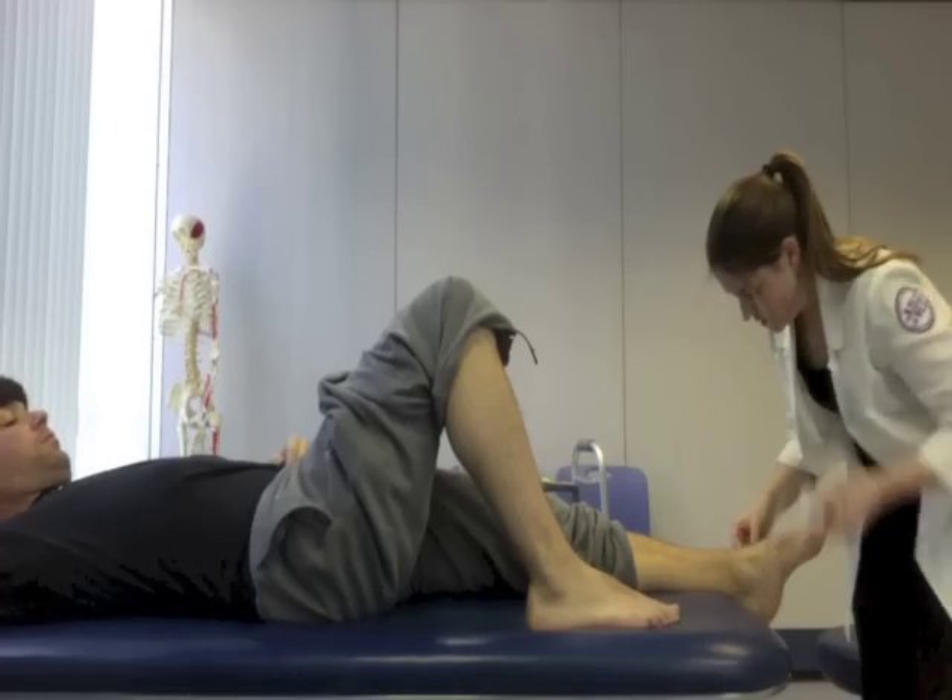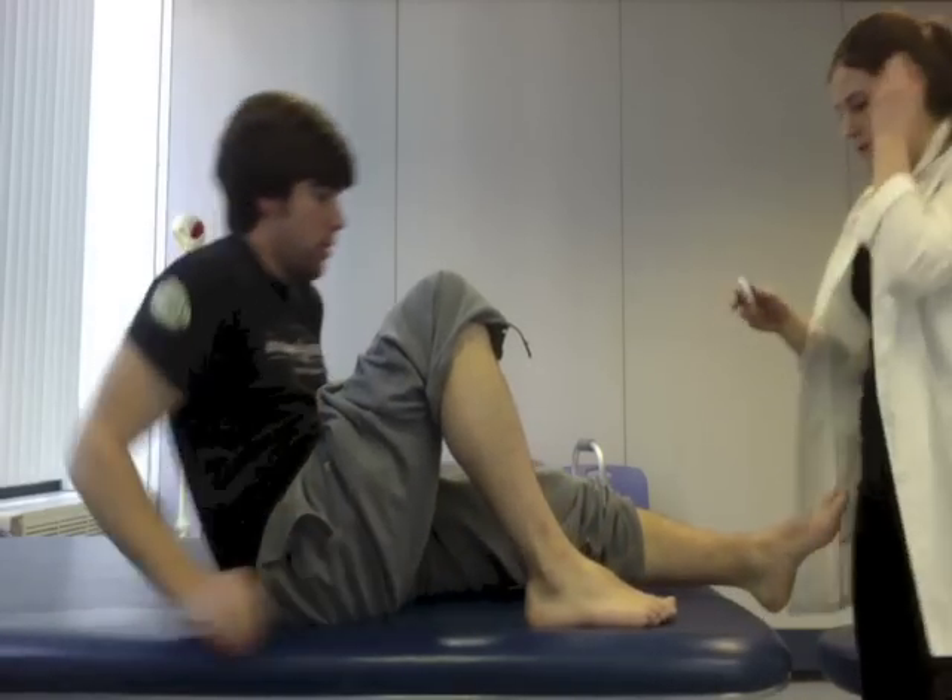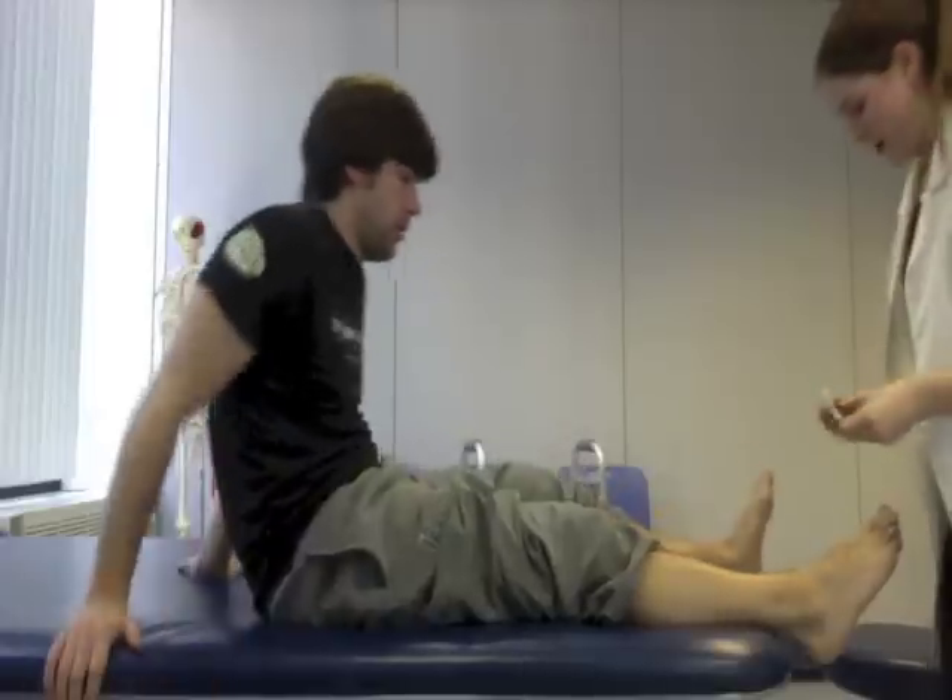Okay good, so for that ankle I got 57 centimeters, so now I'm going to do your right. Was that okay? Yeah, it's fine.